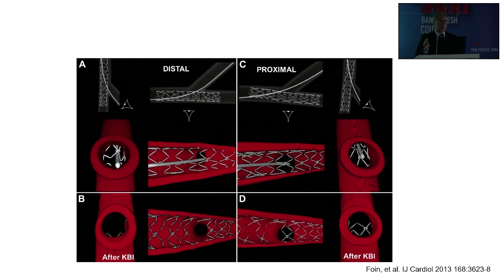The best way to enter in the distal is passing the ostium of the side branch and coming back with the bend on the wire towards the side branch, and see whether you have an idea that you are entering into the distal portion. If you have a mental image of the size of the side branch, that the side branch is here and the size is here, you will try to enter into the distal one. And the main reason for doing that is the deformation of the stent.